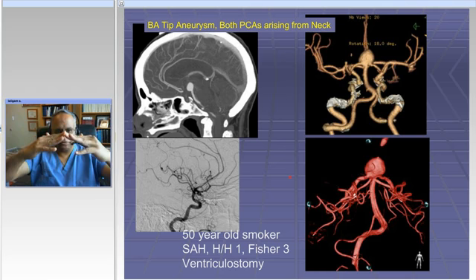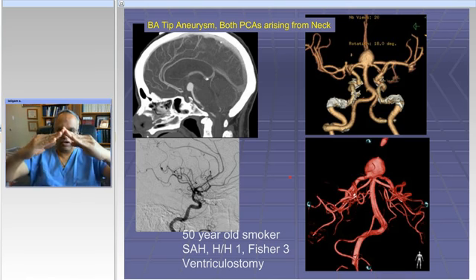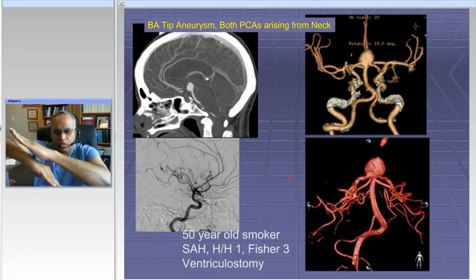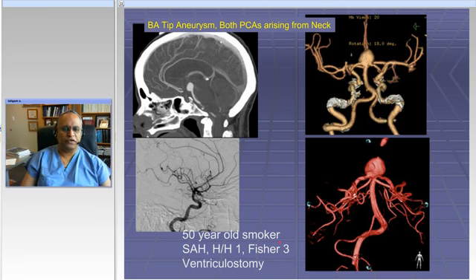This is a patient who's had a ruptured aneurysm. In an unruptured case, one might think about stent-assisted coiling, but still it's pretty difficult because of the fact that the arteries are coming down like this. If they are like this, it's somewhat easier to place a stent here and a Y stent configuration here and then coil. So this is one for surgery.